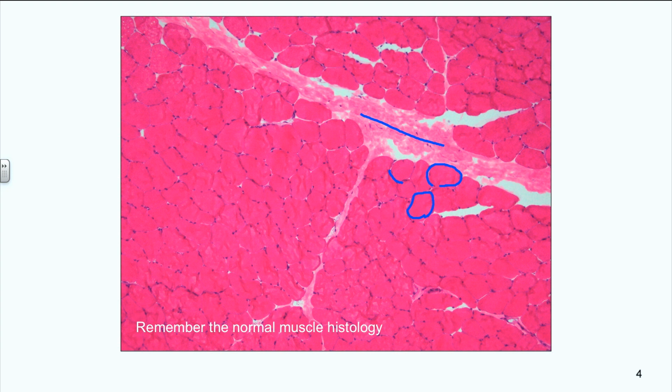We have our polygonal myofibers distributed within a range of variation in size. The nuclei are on the side. Some fibers can have internal nucleation, but their numbers should be very low, particularly in adults. The size does not follow a topography in the fascicle; you don't have small fibers on the side and big ones in the center.